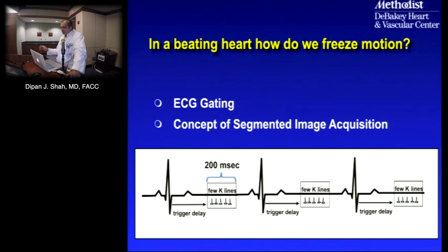And then the other issue is cardiac motion. Remember, the heart is beating continuously, so there's movement occurring almost all the time. So there are very short durations of time in which the heart is not moving, and that's the period of time in mid-diastole between the T wave and the next P wave when the heart is relatively stationary. Well, what's the duration of that time?